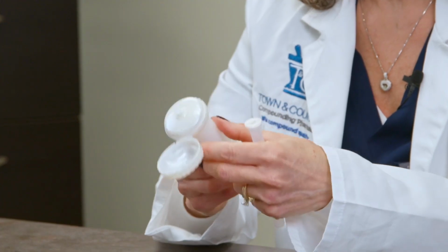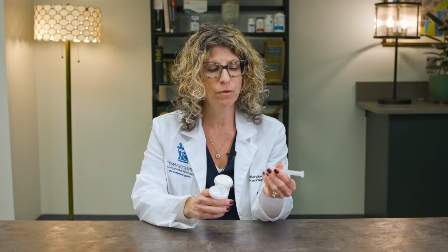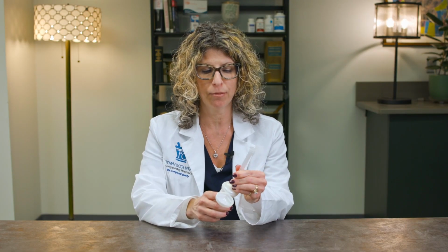The first time you're going to use the cream, you're going to open it up and make sure that the cream is even to the hole at the center. You're then going to apply the applicator. It should snap right on top, and then turn the number of clicks that your prescription indicates. Most women use 4 clicks.